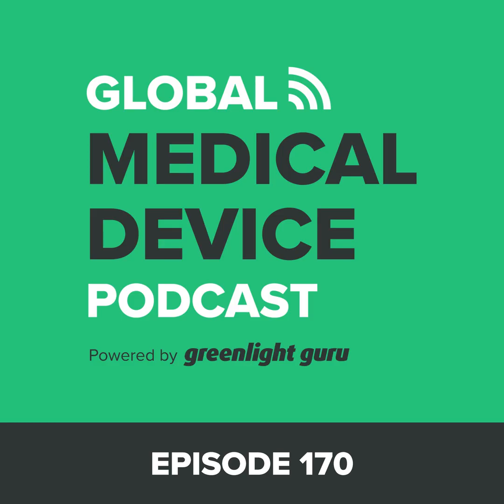All right. So what are some other things that would be expected to be included at the pre-sub stage for software as a medical device? Sure. So I think a good description of the patient population, as well as the intended user. A good description of the patients that the device will be targeted towards, but also the different users who will be using the device. That might be physicians or healthcare providers of all sorts. So that might be nurses, that might be the patients themselves. And so this will influence your risk analysis and your usability concerns.